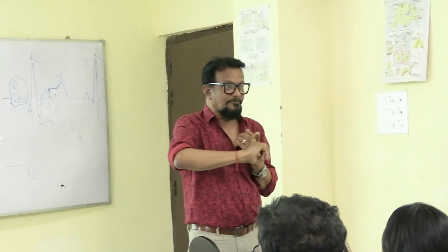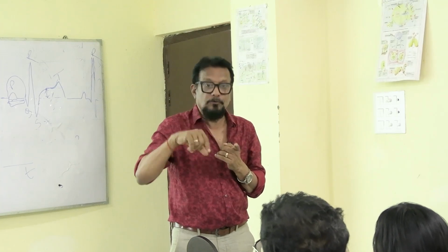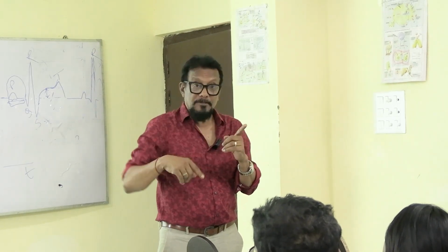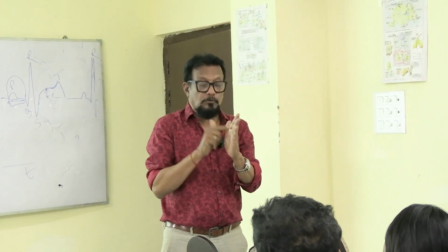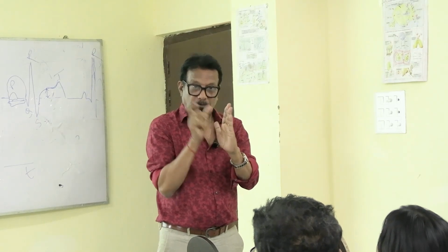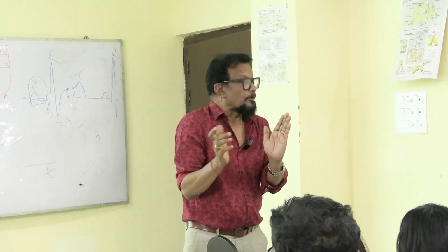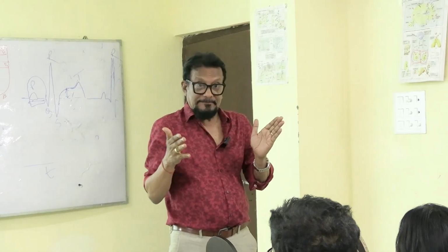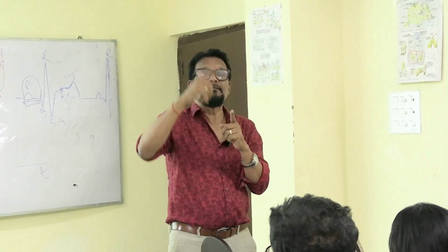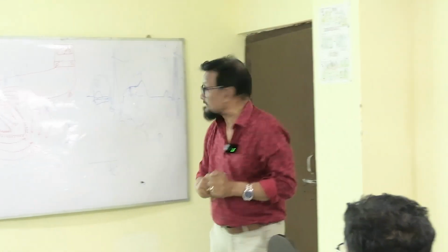So what are the different waves in ECG? These waves are P, Q, R, S, T. We'll see this. Take the Q, R, S waves. For these three waves, normally there is some time duration, 0.08 to 0.1 second. If it is more than this, and the shape of the R wave is biphasic, it means an RR' pattern, or an SS' pattern. I will explain.